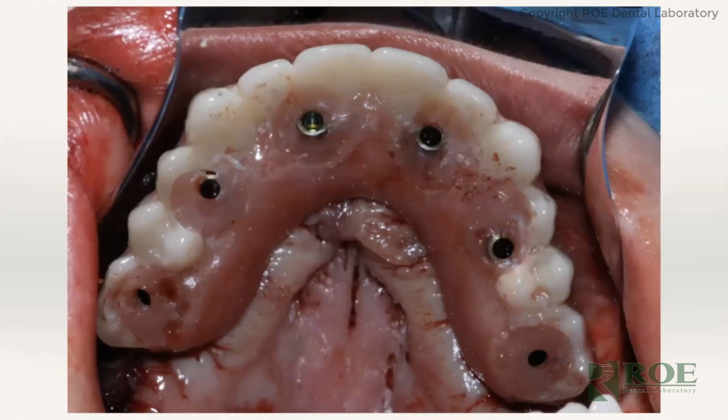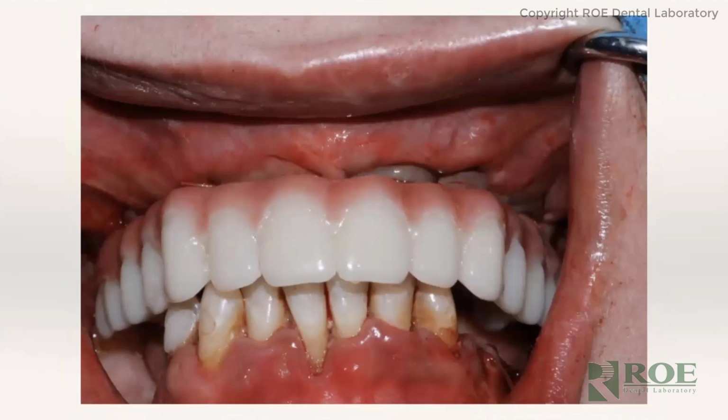It's wonderful. But that assistant doing that has saved so much time for the conversion for us, because we're just able to suture up, and literally they get such pride in making sure that it's nice and clean, that everything looks nice, that it fits properly, and then we get the patient biting into occlusion. Now I do all my patients, like I said, under IV sedation.